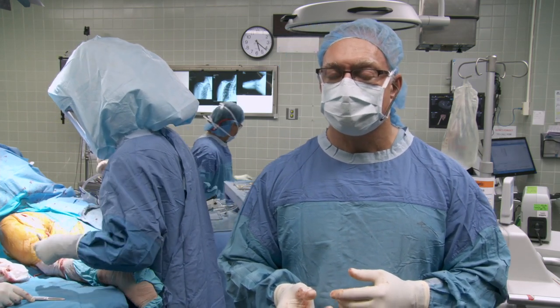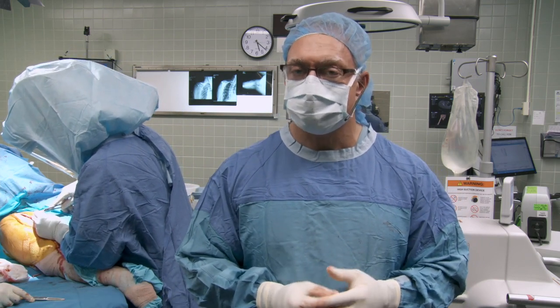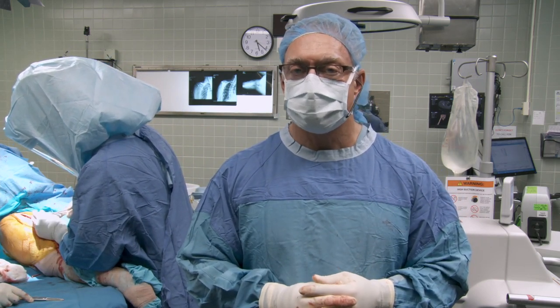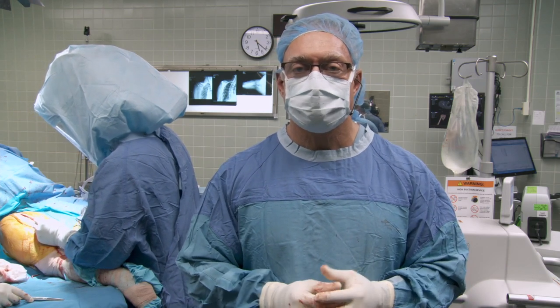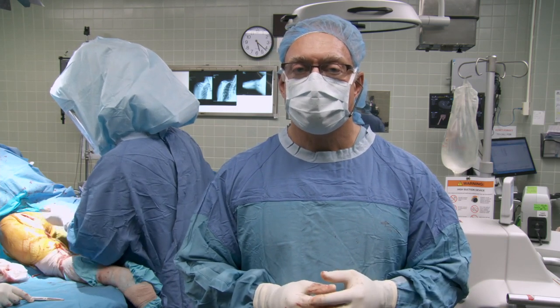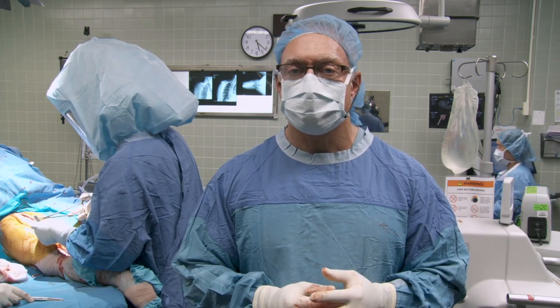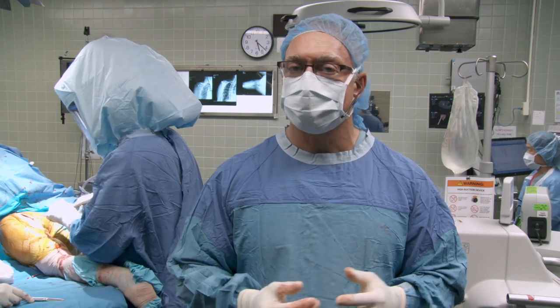This helps with avoiding notching, but in addition it tensions the soft tissues still present and relevant around the shoulder, particularly the deltoid, and allows the patient to reestablish some external rotation, which she had very little strength with prior to surgical treatment. After surgery, she will go to the recovery room and then spend one day with us. Some patients can go home that evening if they're doing well, but most of our patients with reverse shoulder arthroplasty will spend one night. The interscalene block will wear off, and we'll make sure their pain is adequately controlled with oral medications before they're ready to go home.